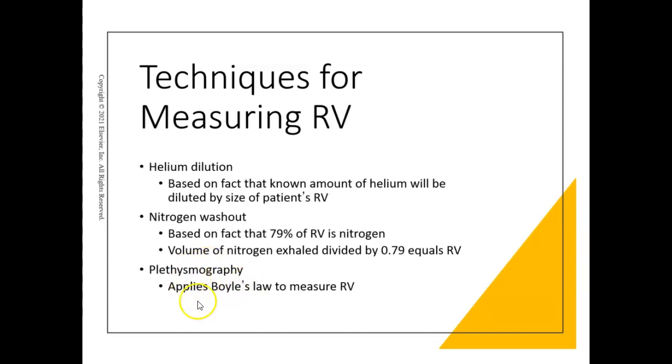So not every patient can perform an accurate plethysmography. Not every patient can tolerate being shut into the closed box. I had a 7-foot tall guy in the PFT lab once, and he was old, an ex-basketball player back when Sheboygan had a professional basketball team.